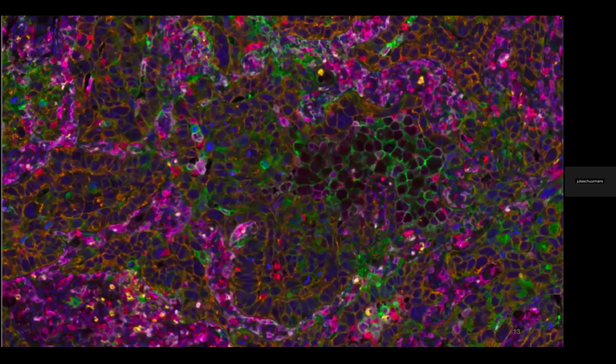Okay, so this here is a gorgeous multiplex image of the axis panel. This is the same panel that I showed you guys at the very beginning of my presentation. In the dark blue here, which is scattered everywhere, this is DAPI. Those are your nuclei. That's a single cell. And then if you look at the green here, this is PDL1, which is outlining a bunch of alveolar macrophages. If we look for the orange, that is our pan cytokeratin marker. Those are all of your tumor beds throughout the image here. If we look for the red, these little red circles here, nicely outlining a bunch of cells, those are your CD8 cells, your cytotoxic T cells.